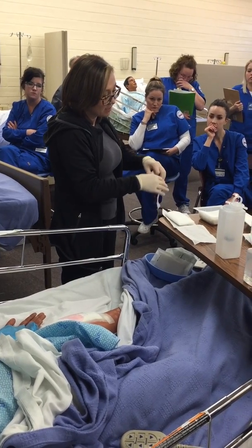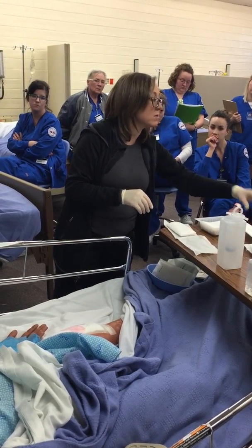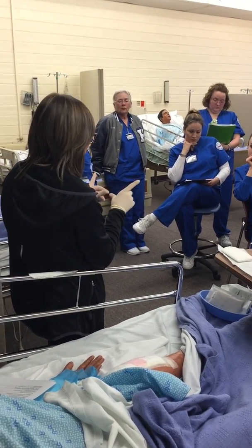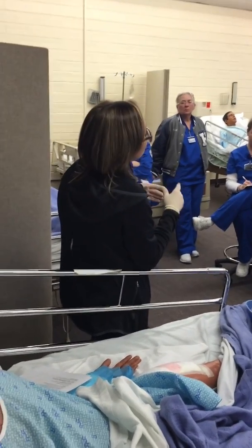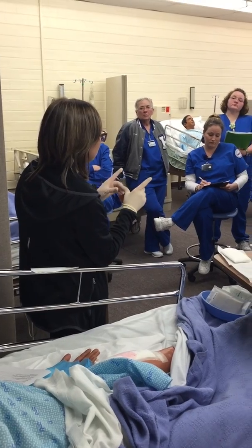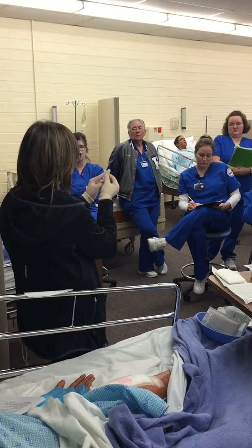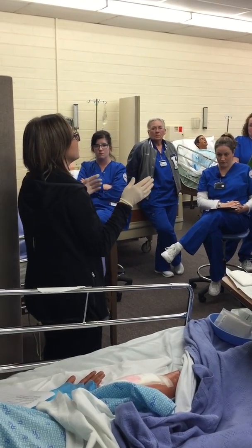And in your skills kit, you should have the equipment to measure, and you should have sterile Q-tips. Were there any sterile Q-tips over there? If you get sterile Q-tips, and we used to have them, or they used to come in your kits, it has on the side a measuring instrument, which is like a ruler on the paper, because when you're doing wound changing, you don't want to use stuff back and forth. Everything needs to be disposable per se. So when you open up the sterile Q-tips, take your Q-tip out, you can measure the depth of the wound, and then you'll see where it's on there, and then you can measure it. It's not always something you have to do. It's more like what the wound care nurses do, but it helps you to determine if it's healing better or whatever.